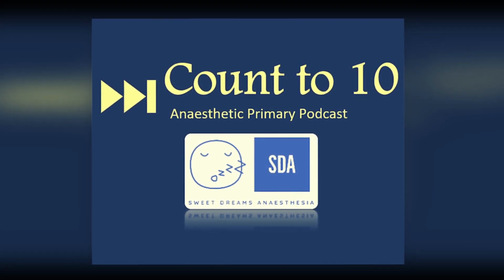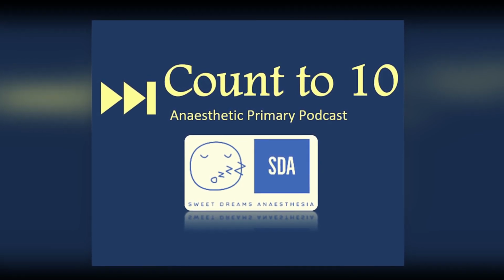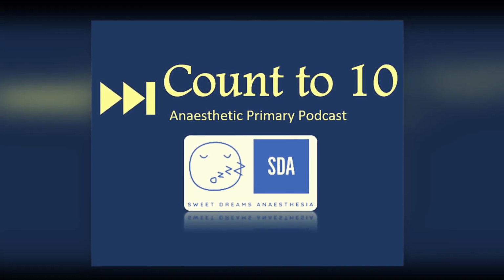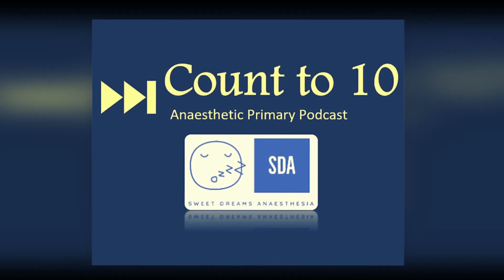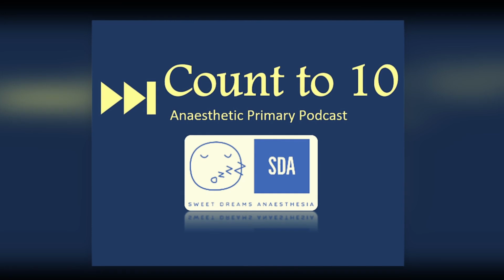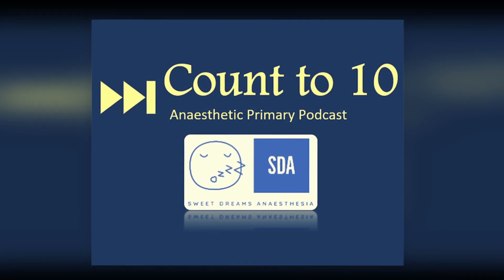Other questions they love to ask is why did they pick the red light and the infrared light? Now there's no great answer for this. It's simply because these two lights were far enough apart that there was a marked difference between oxyhemoglobin and deoxyhemoglobin absorbance, and they were cheap lights to produce. So historically, it made producing the pulse oximeter easy for the manufacturing companies.